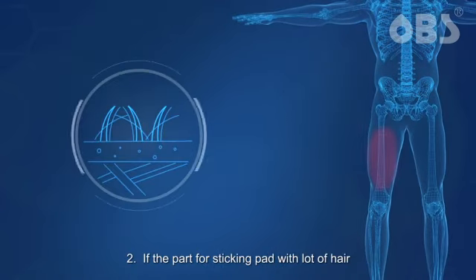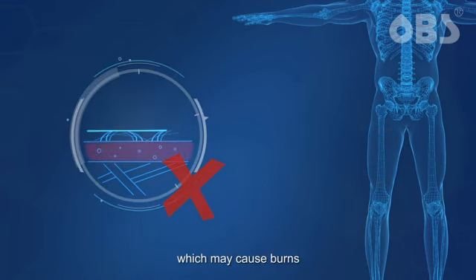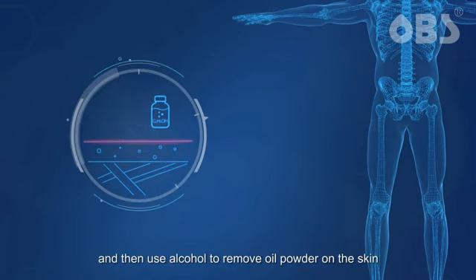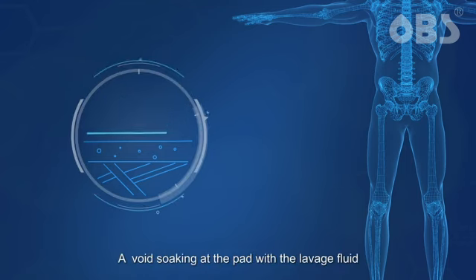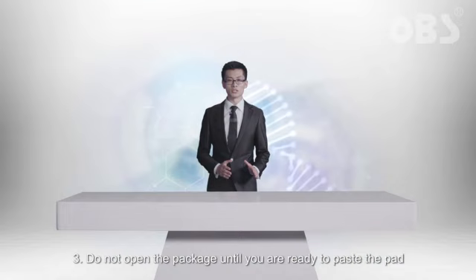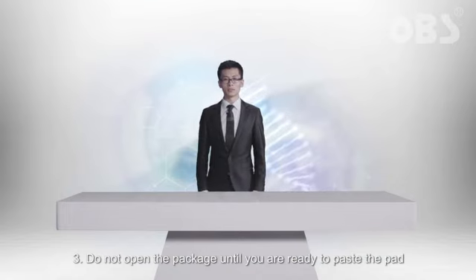2. If the part for sticking the pad has a lot of hair, it is likely to cause the current density to be too large, which may cause burns. Therefore, first shave the hair and then use alcohol to remove oil and powder on the skin. Wait for it to dry and then paste the pad. Avoid soaking the pad with lavage fluid, which may reduce the adhesive force between the pad and the patient.